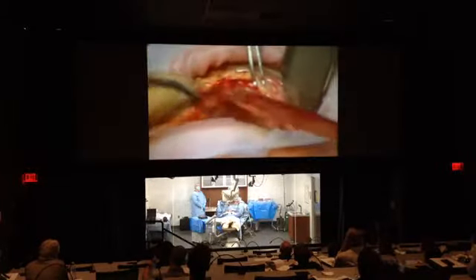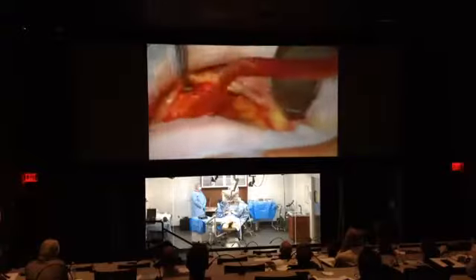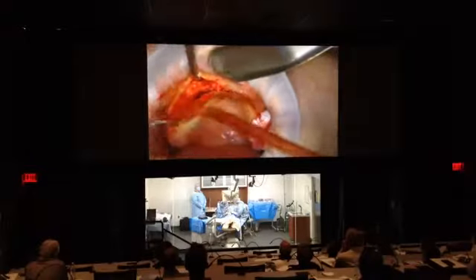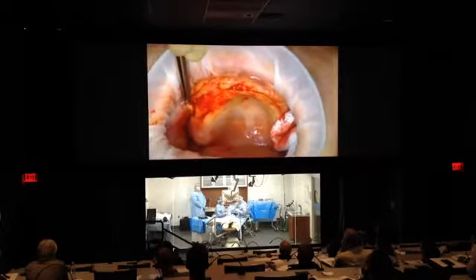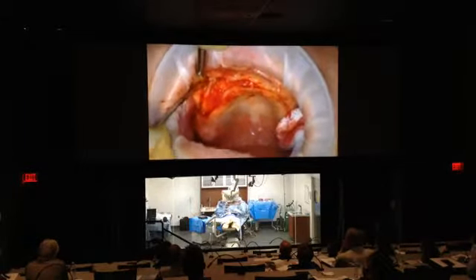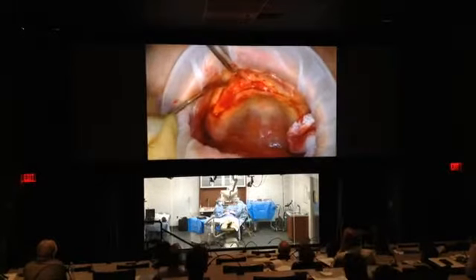This is that fibrotic part that I was telling you about. I'll make sure we remove it. So let's see. We have this vertical here that could be a little bit higher. You mean the larger elevator? So I'm going to reflect this a little bit more here. Sometimes when I reflect the posterior enough, you'll be able to see the shadow of the sinus, so we know to avoid it. Especially when the bone is thinner, you'll be able to see a window right here where the sinus would be.